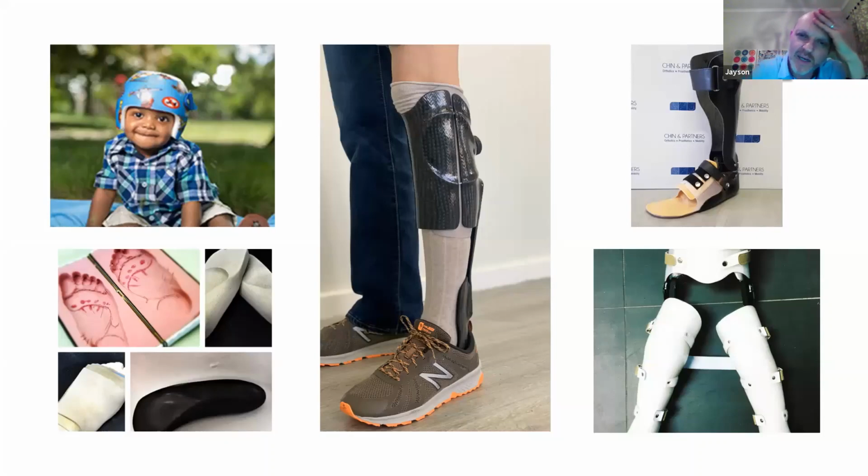This is actually a hybrid between a below-knee prosthesis, where you've got patella tendon weight bearing, you've got weight bearing along the medial and lateral aspects of the tibia, and then you're immobilizing the ankle with a strut along the back to provide energy return. The image on the right is a standard ankle foot orthosis, hinge brace, often used for your drop foot patient or for your various ankle conditions.